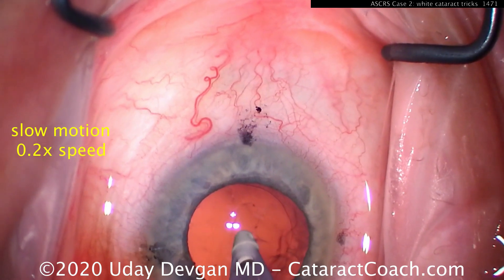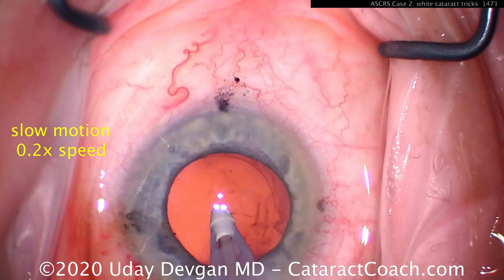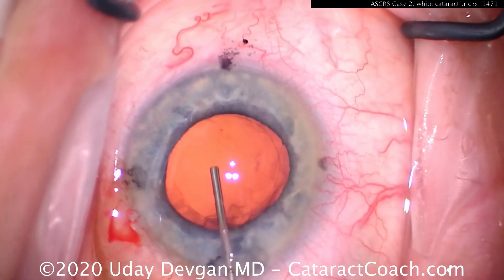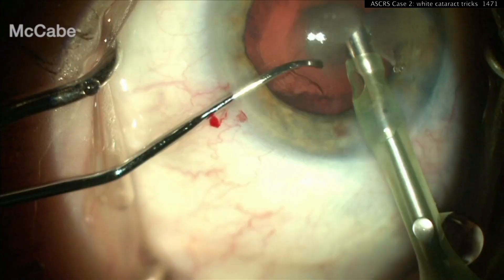Now here's another case of me operating. Look at the slow motion — just a routine case, cleaning up the capsular bag, and there you go: popped a hole in the posterior capsule. So what do we do here? We fill it up with viscoelastic first. Don't let that eye collapse.